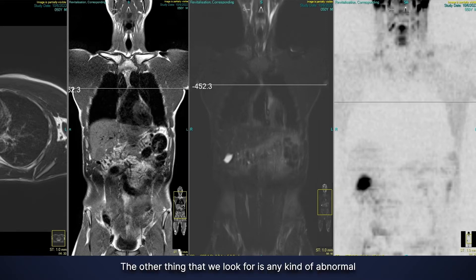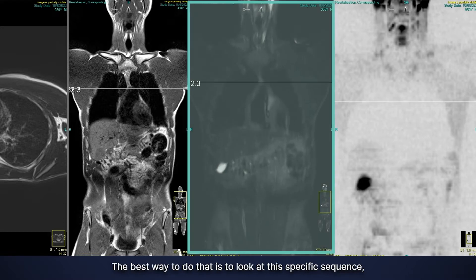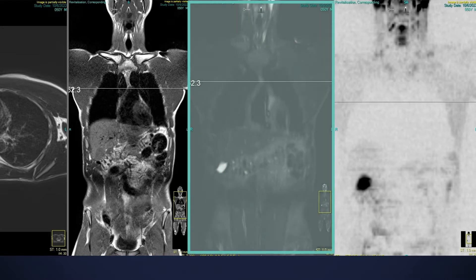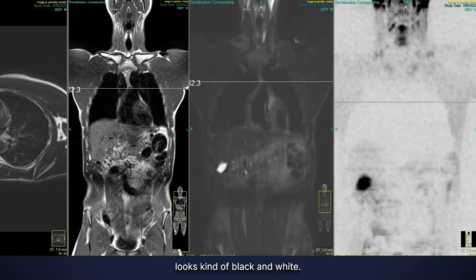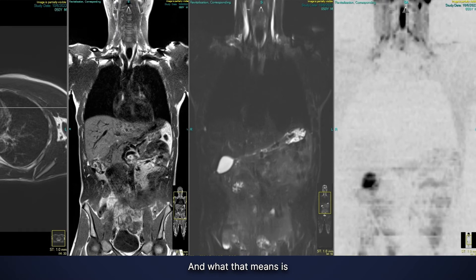The other thing that we look for is any kind of abnormal fluid accumulation around the lung. The best way to do that is to look at this specific sequence — it looks kind of black and white — and anything really bright or white is going to be fluid.